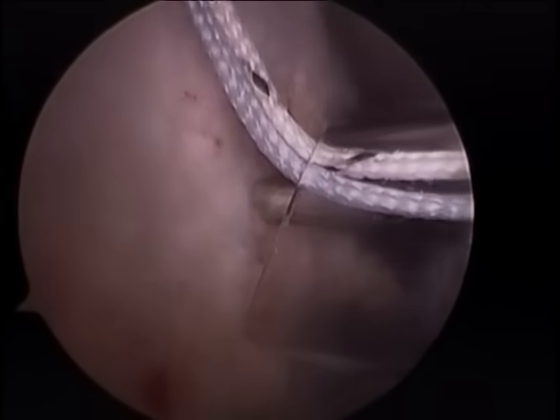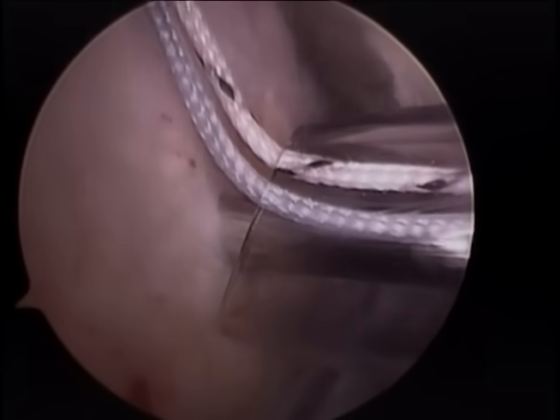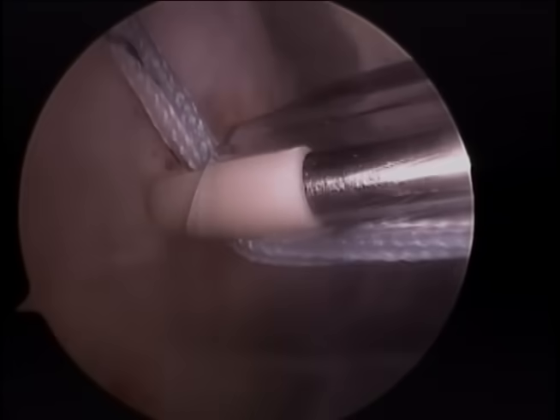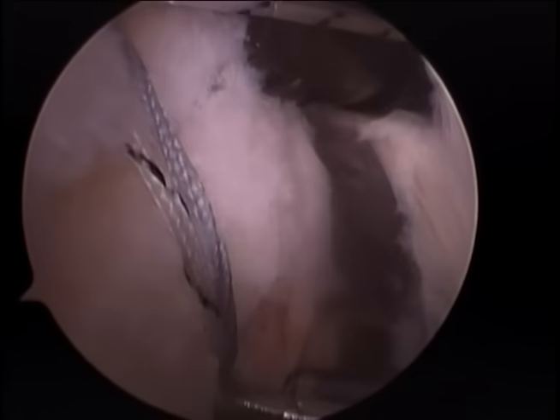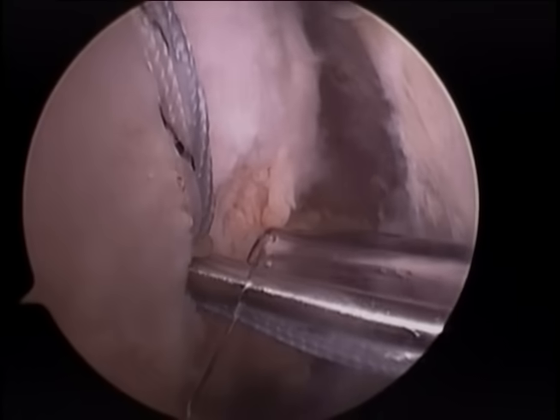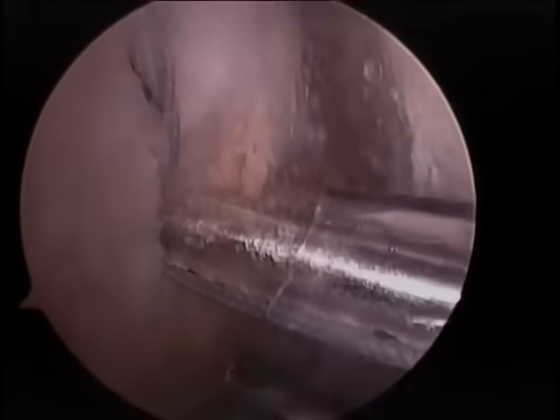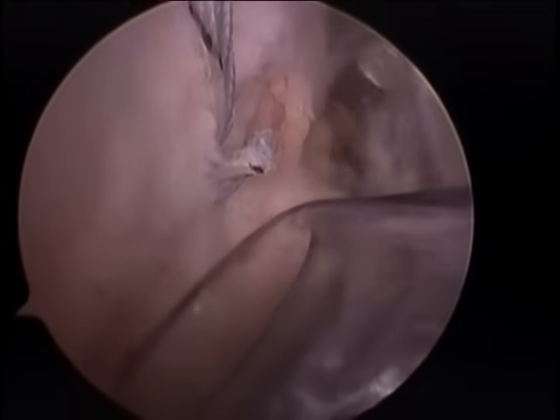Our punch feels and confirms the bone is solid, and we make a pilot hole, as you see here. We then place the loaded push-lock anchor into the pilot hole. Before we seat the anchor, we pull the slack out of our sutures to assure the tendon is snug down. When we are pleased, we seat our anchor, as you see, and we cut the ends of the suture.